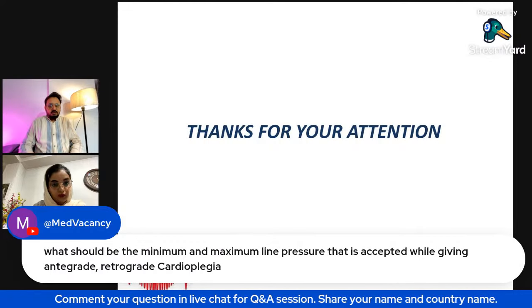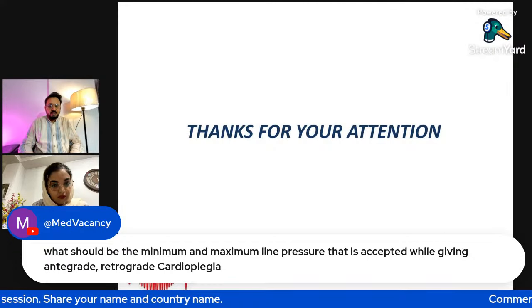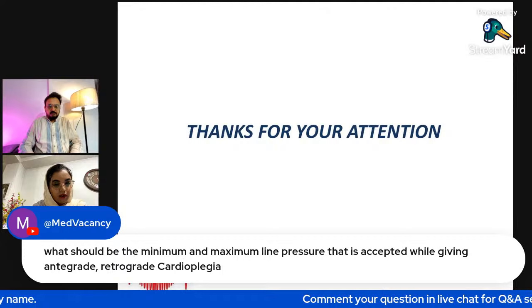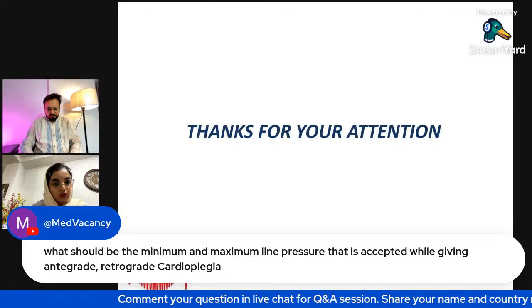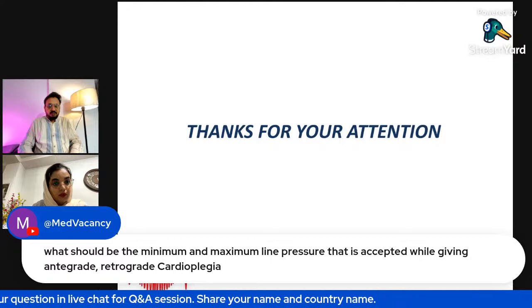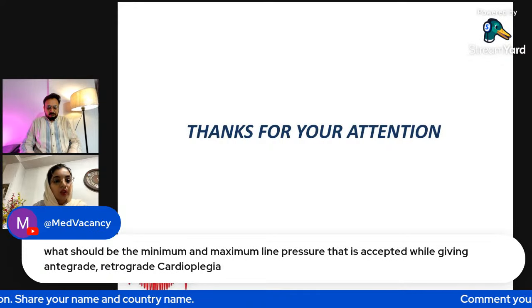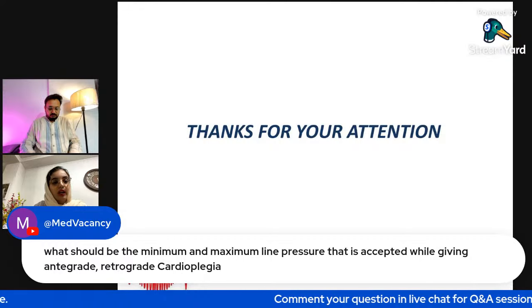Okay, we have one more question. What should be the minimum and maximum line pressure that is accepted while giving antegrade and retrograde cardioplegia? It means, what happens if we inject at high or low pressure? Whenever we give cardioplegia, the normal range for antegrade is 60 to 100.